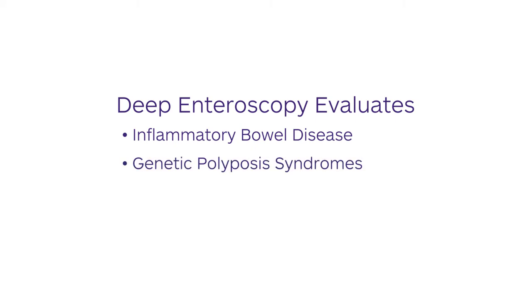In many cases, a non-invasive radiographic or capsule examination is first performed in order to properly select an appropriate patient and approach. While commonly performed for therapeutic purposes in the case of suspected small bowel bleeding, deep enteroscopy can also be considered part of the evaluation of inflammatory bowel disease, genetic polyposis syndromes, unexplained abdominal pain, or diarrhea. The diagnostic yield varies depending on indication and patient selection, but can approach 80%.